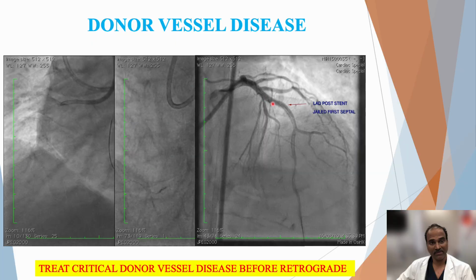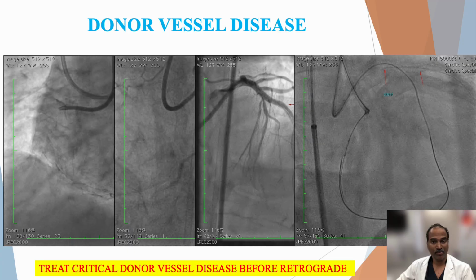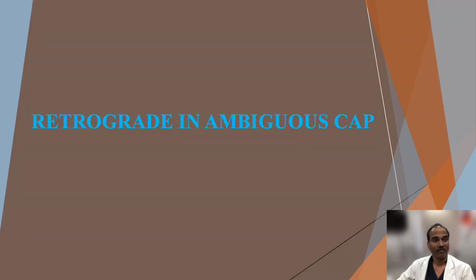It doesn't matter even if struts are across the septal. You can go through those struts and you can finish the procedure. But it improves the safety when you address donor vessel disease before touching your CTO.